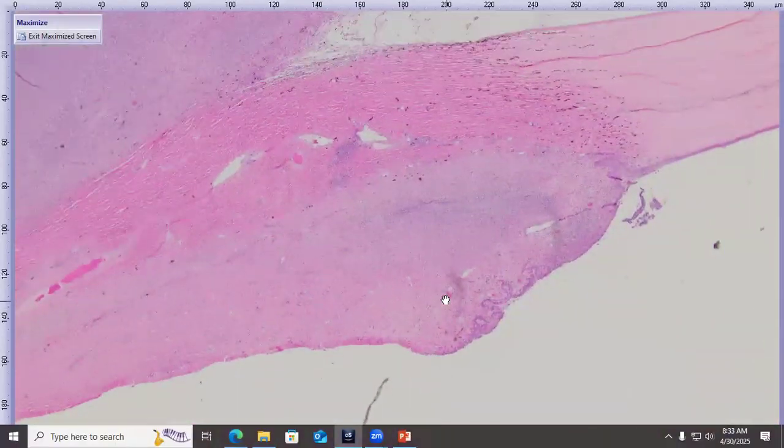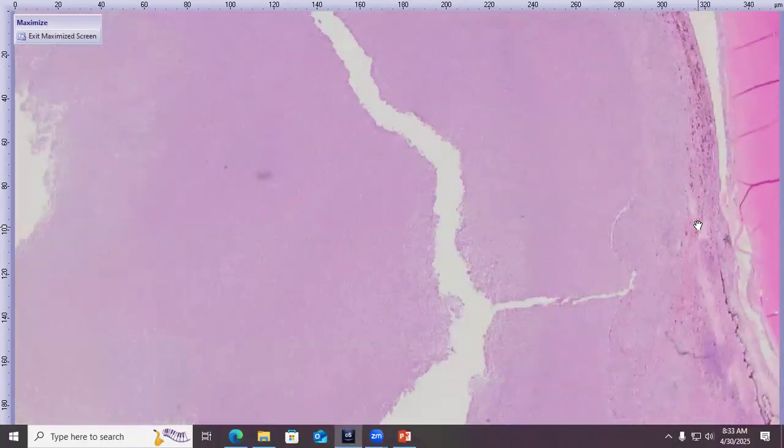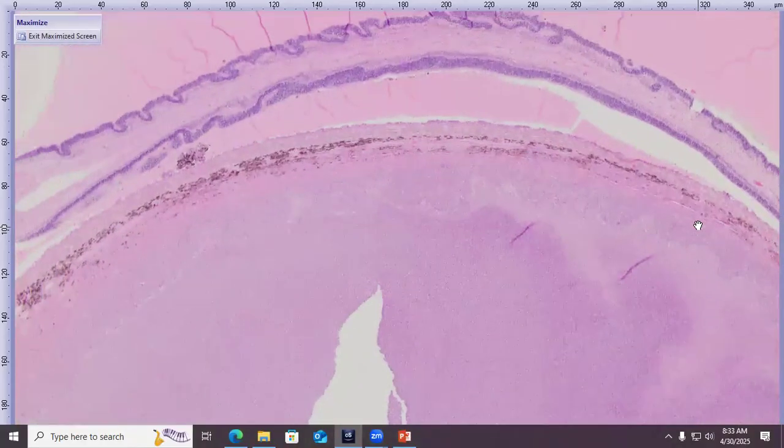While we're on low magnification, there's this interesting area that's a little bit too purple up in dorsal bulbar conjunctiva. Very interesting. We'll take a closer look at that in a hot second. But let's address the elephant in the room first. I'm famous for not addressing the elephant in the room, so we'll change that.